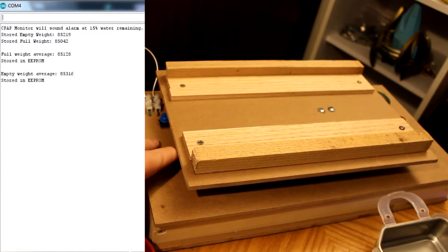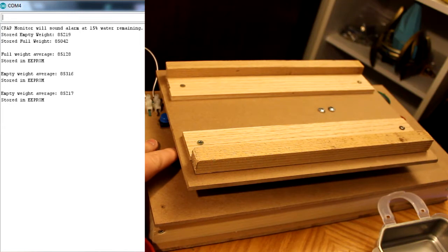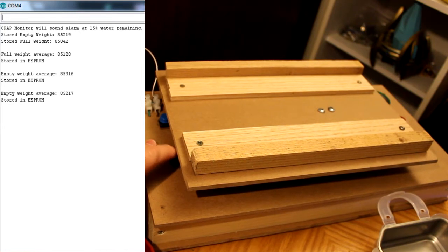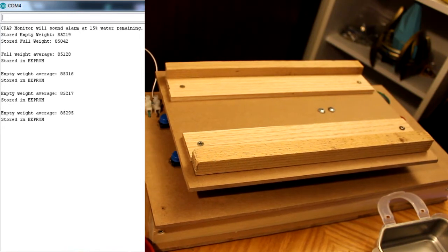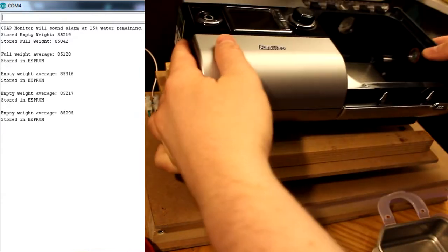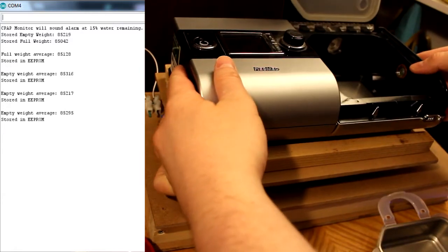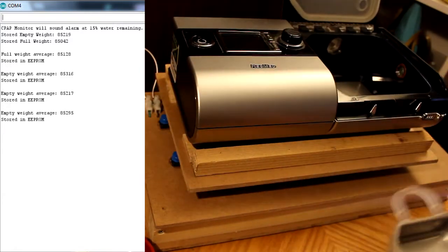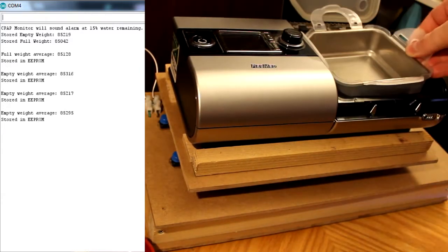One button stores the weight of the scale with no water in the reservoir, and one button stores the weight with the reservoir full. These values are used with the desired water percent remaining to determine the alarm mode.